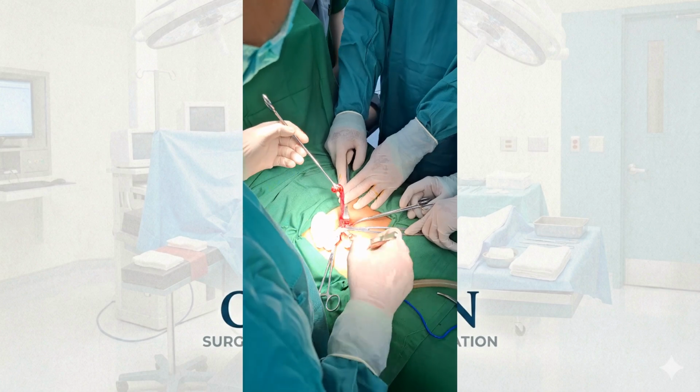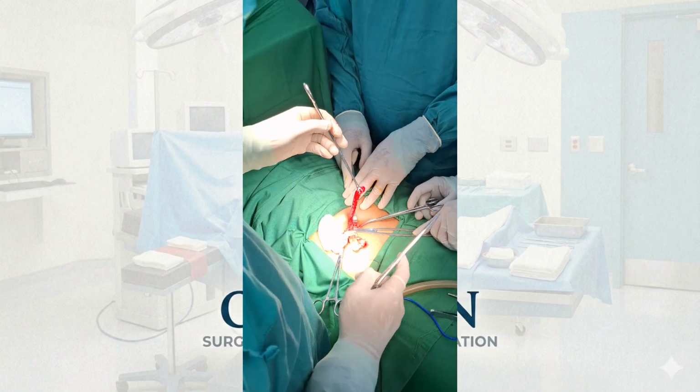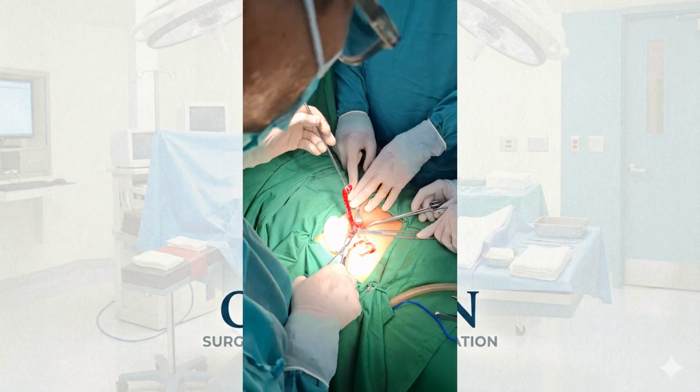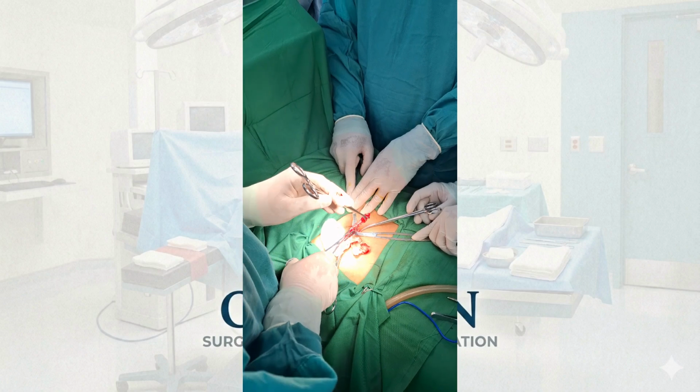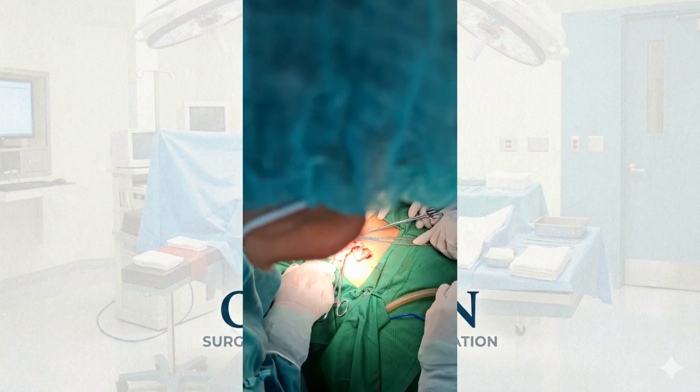The base of the appendix is now carefully ligated. This step ensures that the connection to the cecum is securely closed before the inflamed organ is removed. Precision in this step is vital for a successful recovery.